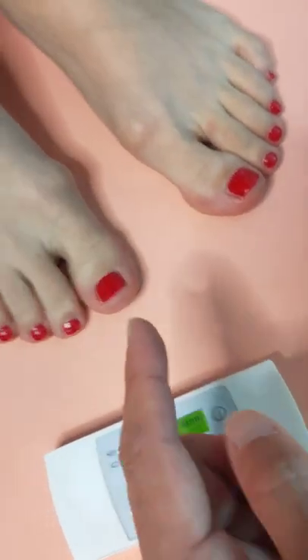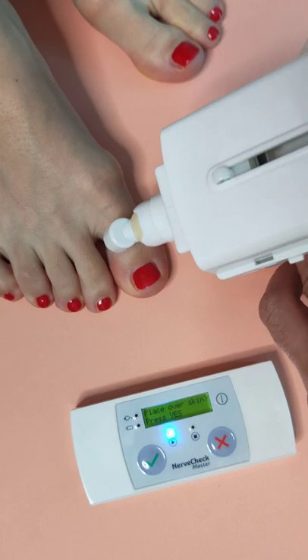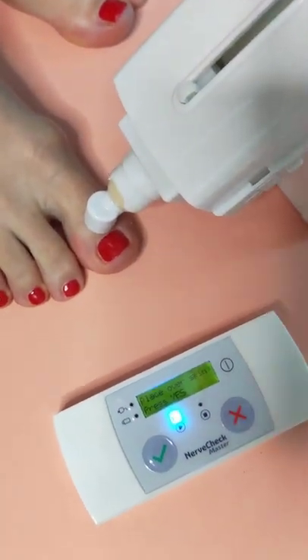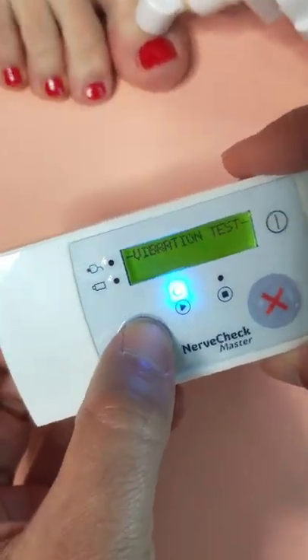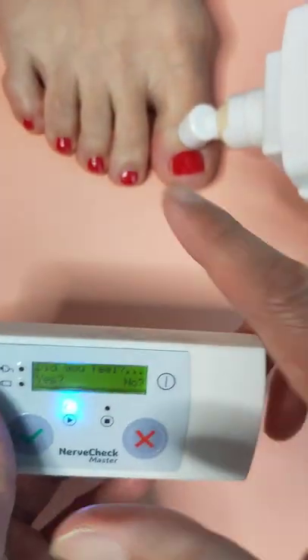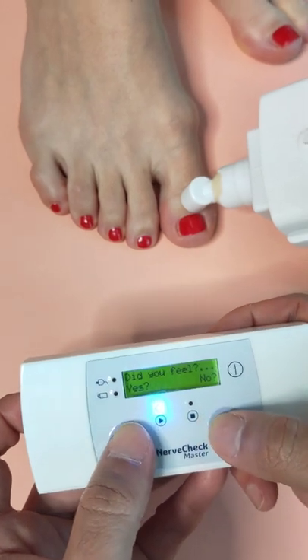For the vibration test we're going to apply it on the large toe right above the nail — like this. Make sure you're touching the skin. Press yes for the vibration test and this red light indicates that the test is ongoing — that's where you express yes or no whether you felt it.